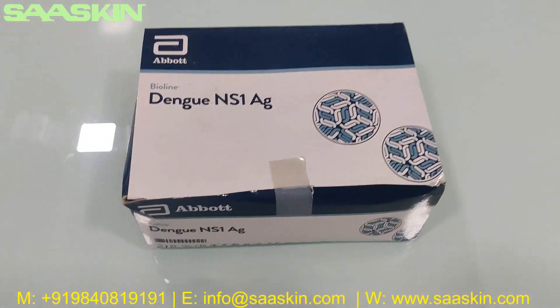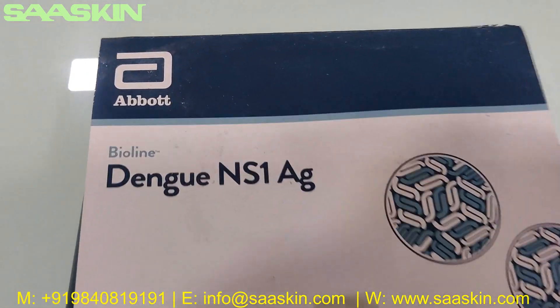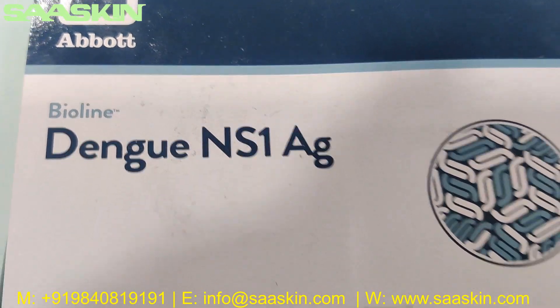Hello everybody, today we are going to see the unboxing of the Abbott Bioline Dengue NS1 Ag test kit.